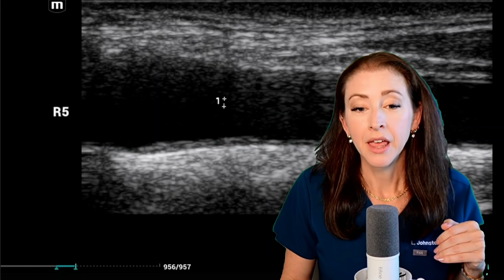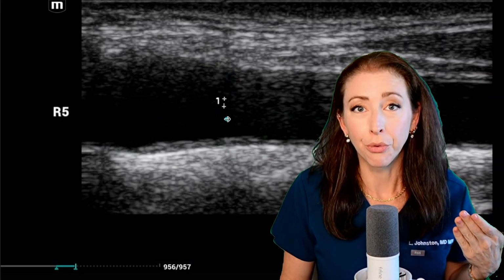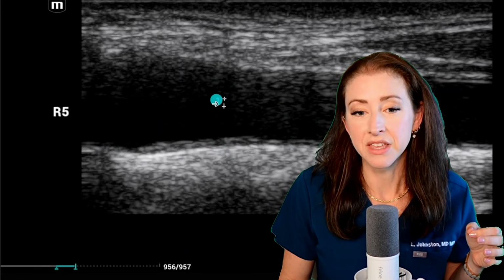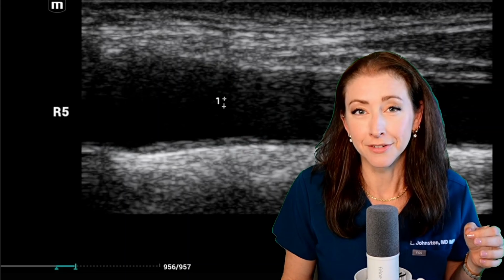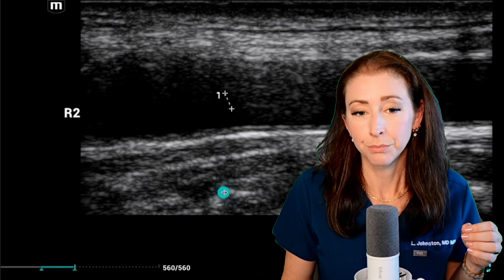That's all we're measuring. On this picture, these little plus signs, that just is where I'm making a note for the image interpreters that this is about where the bulb starts. So they're going to take measurements only to the right of this marker here, and they'll make 100 measurements off of this one image. Then I'm going to take a second image, same general picture.